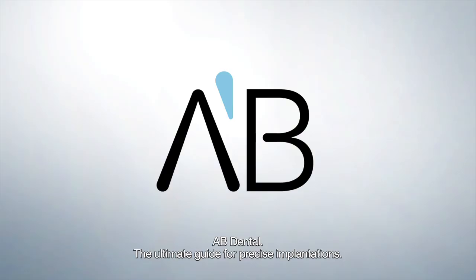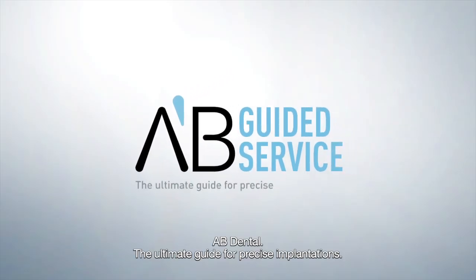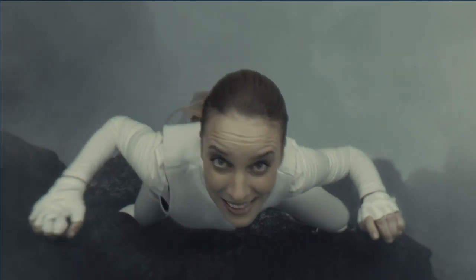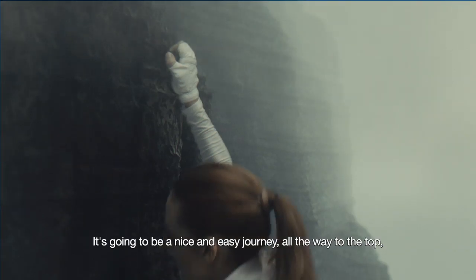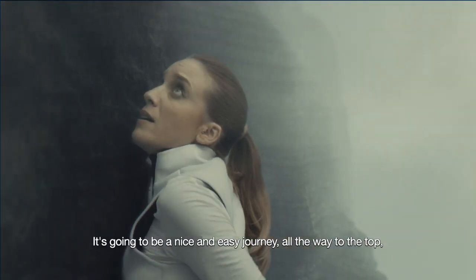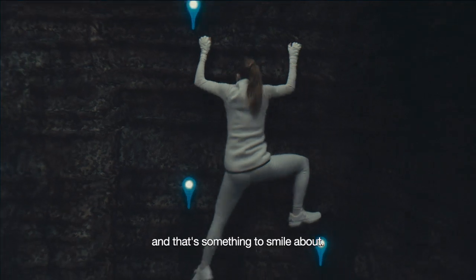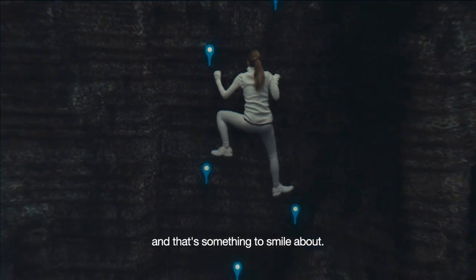AB Dental – the ultimate guide for precise implantations. It's going to be a nice and easy journey all the way to the top. And that's something to smile about.